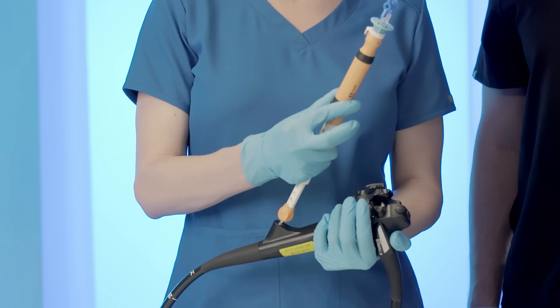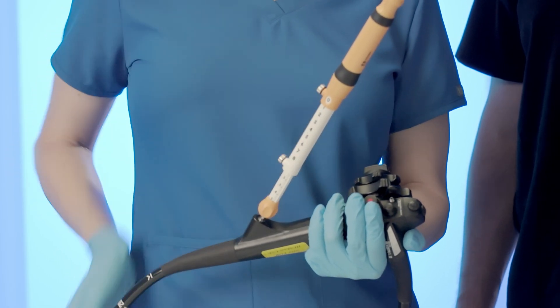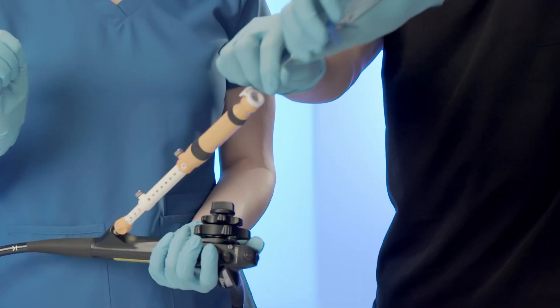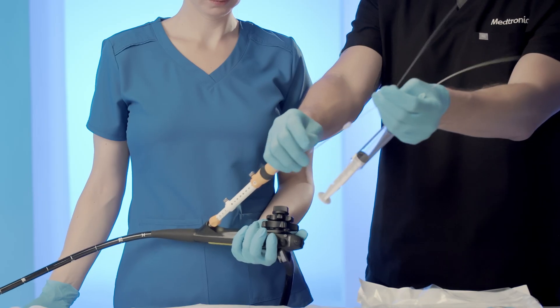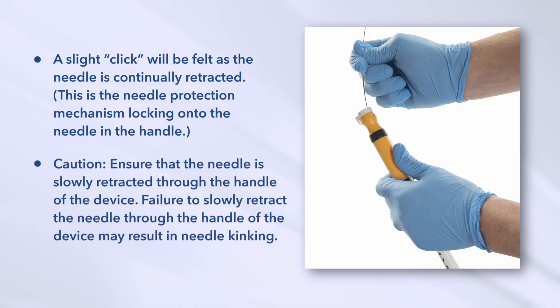Do not remove the needle from the biopsy site during tissue sampling. Upon completion of tissue biopsy, retract the needle into the sheath by pulling back on the handle of the device. Lock the thumbscrew on the safety ring at the zero centimeter mark. To remove the needle from the handle of the device, depress the thumb latch on the handle to release the needle and retract it from the handle. Carefully and slowly retract the needle until slight resistance is felt approaching full needle exit from the handle, then continue to carefully retract the needle. A slight click will be felt as the needle is continually retracted — this is the needle protection mechanism locking onto the needle in the handle. CAUTION: Ensure that the needle is slowly retracted through the handle; failure to do so may result in needle kinking.